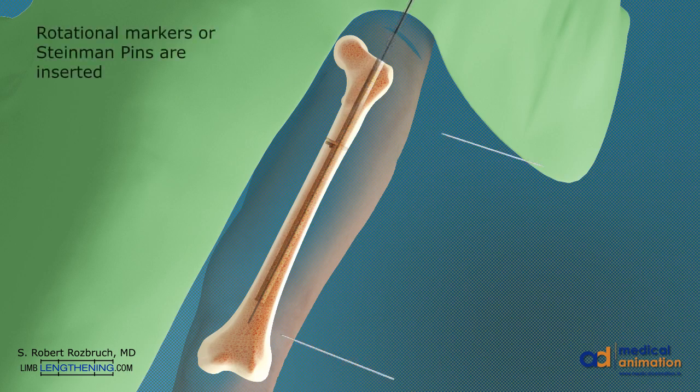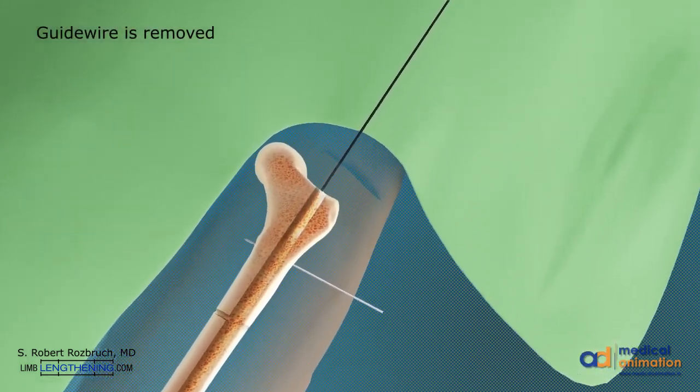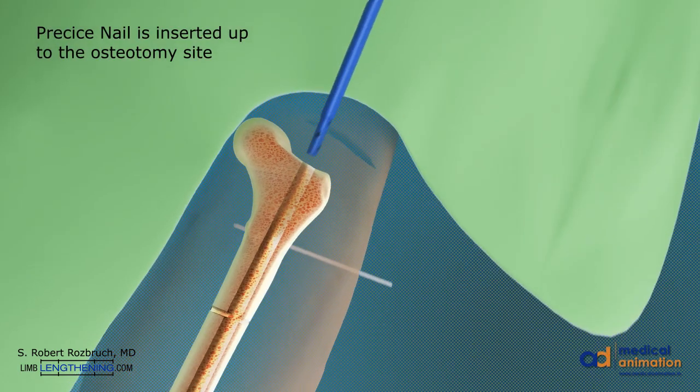Rotational markers are inserted into the proximal and distal segments. The guide wire is then removed.